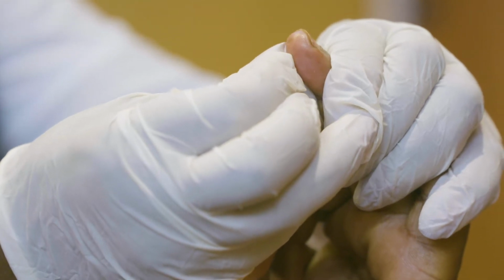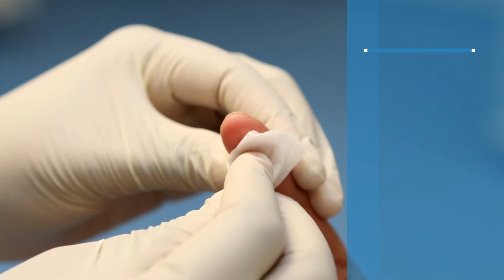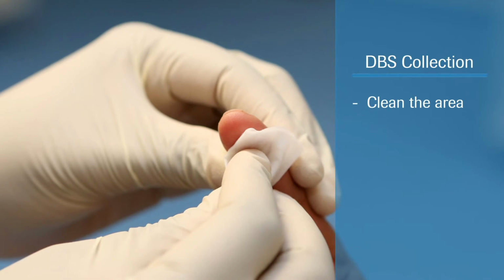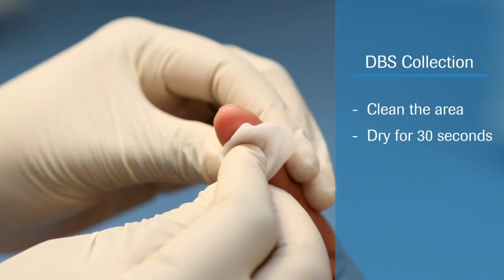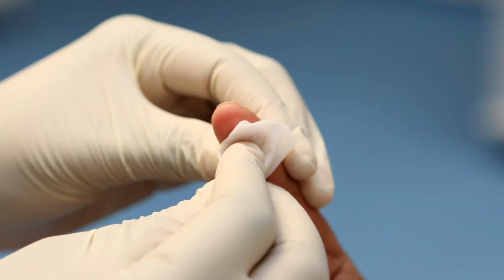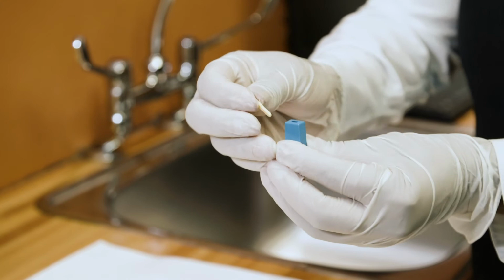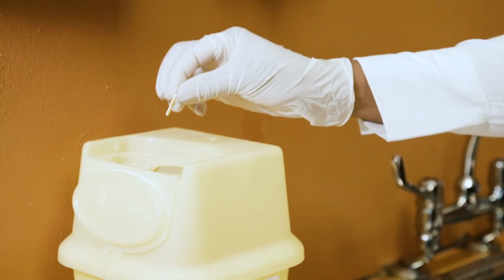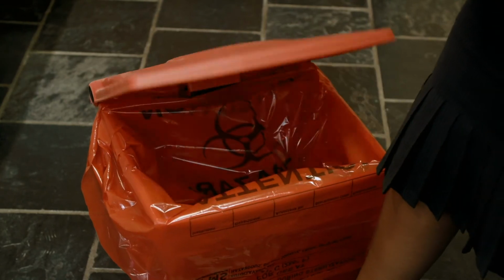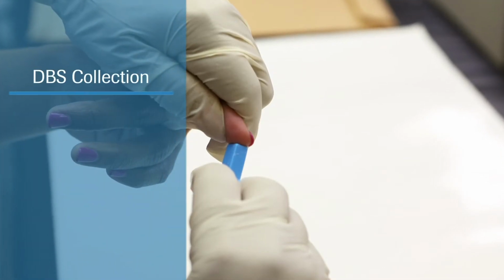Clean the area to be pricked and wait 30 seconds for the area to dry completely. If the area isn't completely dry, the spirit or alcohol may mix with the blood and cause the sample to be invalid. While waiting for the area to dry completely, uncover the lancet blade and dispose of the guard as soon as possible in regular or biohazard waste to prevent choking. The lancet should be used immediately after uncovering the blade.